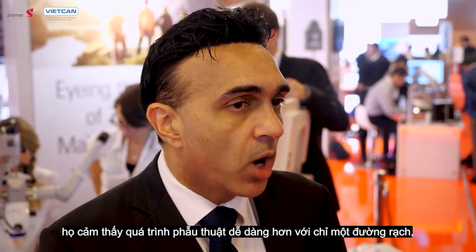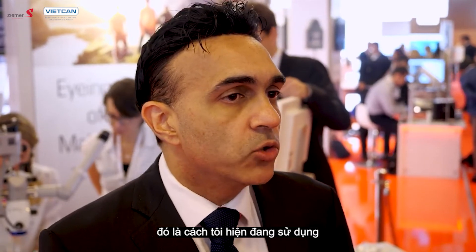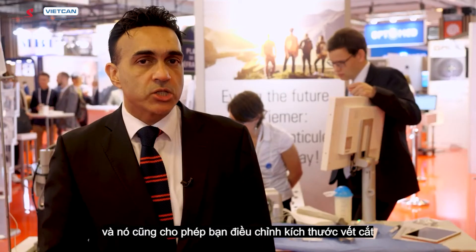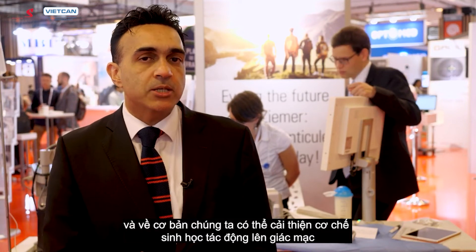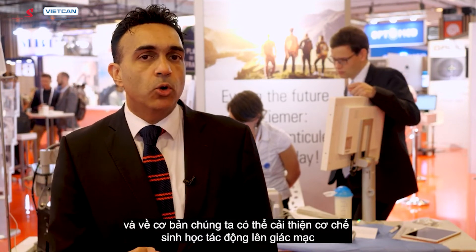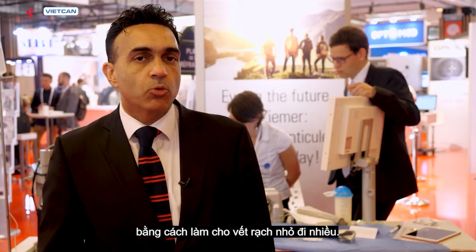For more experienced surgeons, it may be easier to use just one incision, which is what I currently use. It also allows you to adjust the incision size to reduce the amount of surgically induced astigmatism and improve the biomechanical effects on the cornea by making the incision much smaller.